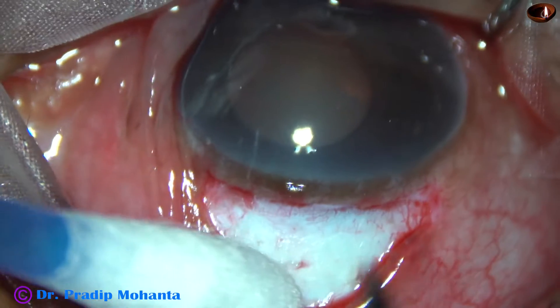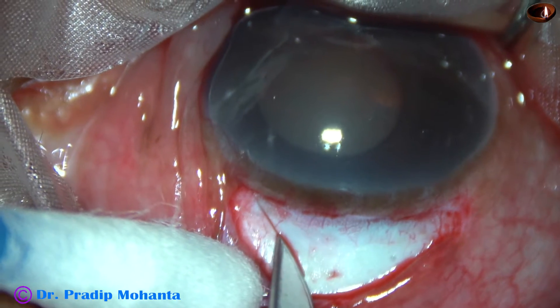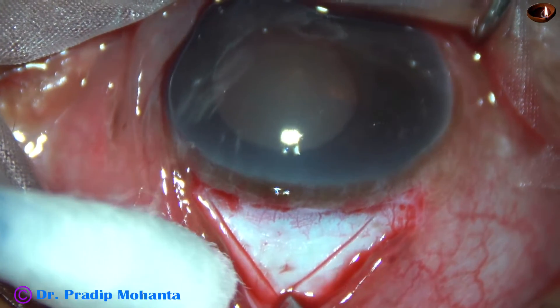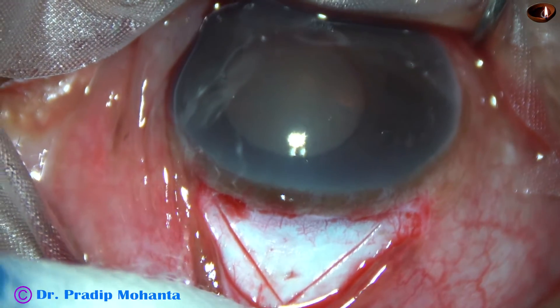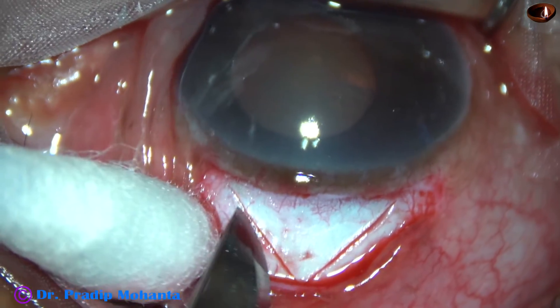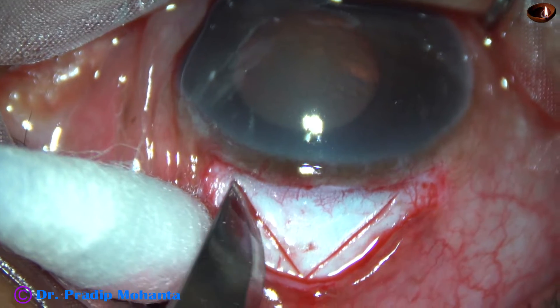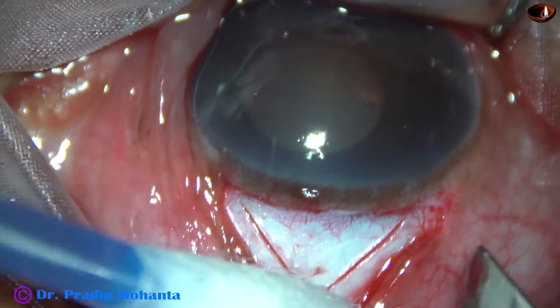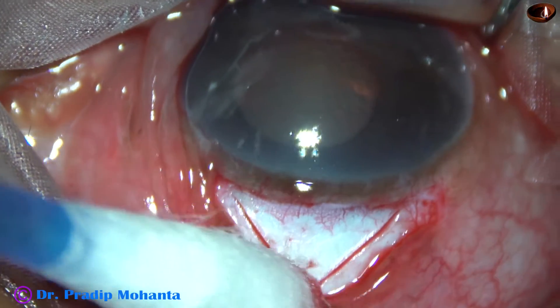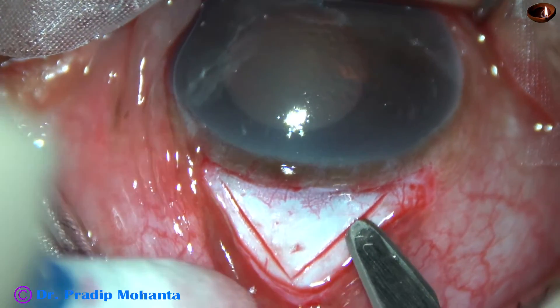Now a triangular scleral flap is raised. This is one incision, this is another incision. The base of the triangle is at the limbus. Now I go to a certain depth — in this case the depth was a little more; it could have been a little less. I went to about two-thirds depth.